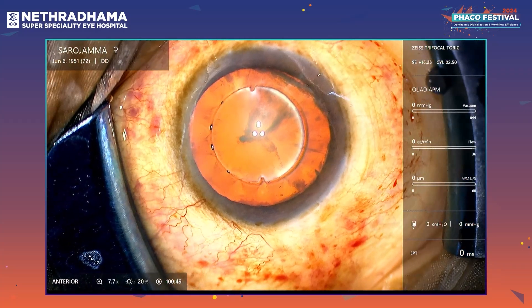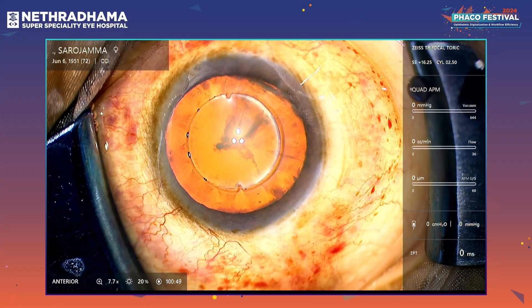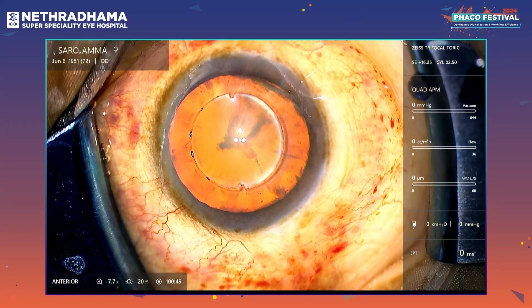This is the system; it is connected to the pentacam. We are starting with the live surgery now. Welcome everyone to the cataract OT of Netradama Eye Hospital. We are starting with the first case today.